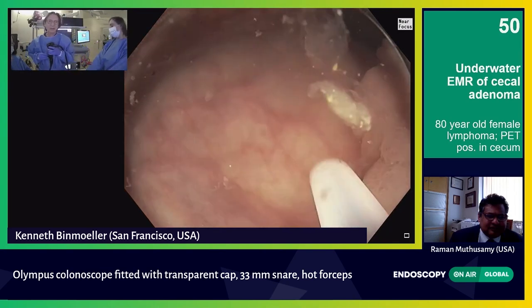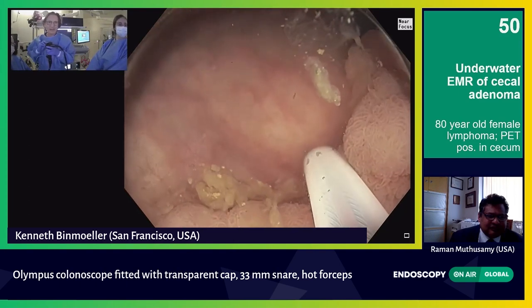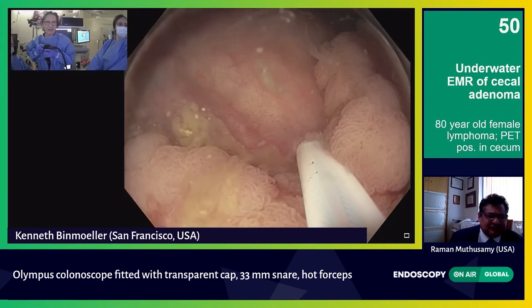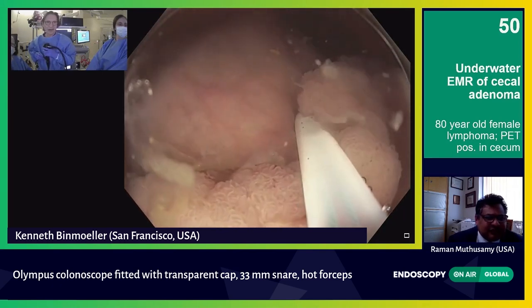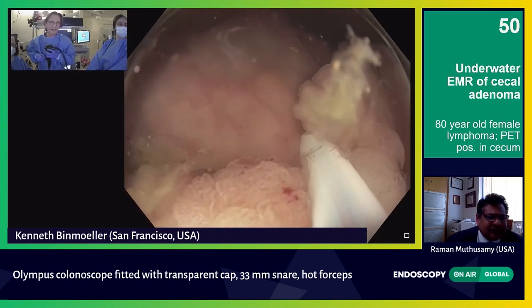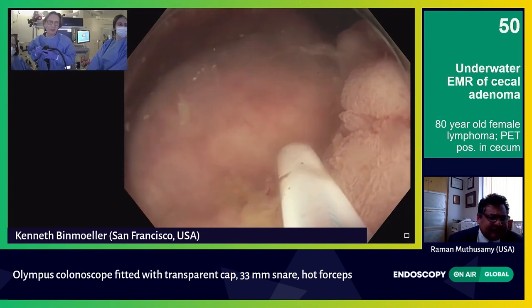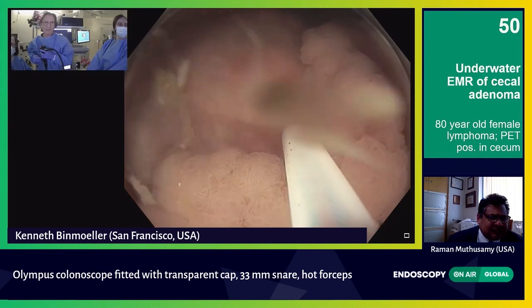Because some of this is overhanging, I use the catheter to pull over like this. Let's take the near focus off, and then I'll make a dot like that. You can see a dot there, and then I can make a dot here. They're nice and crisp underwater. You can make a dot here. Even though I'm not seeing exactly where the transition point is, I'm using the catheter to pull this over, give a little bit of water, and then make my dot.